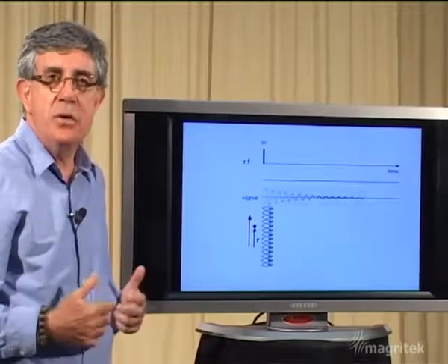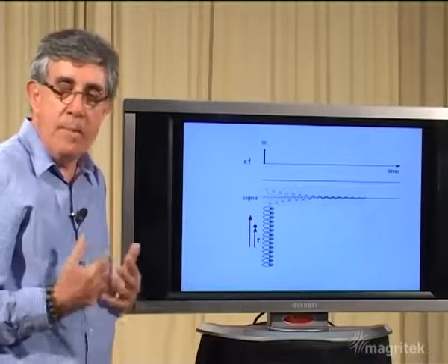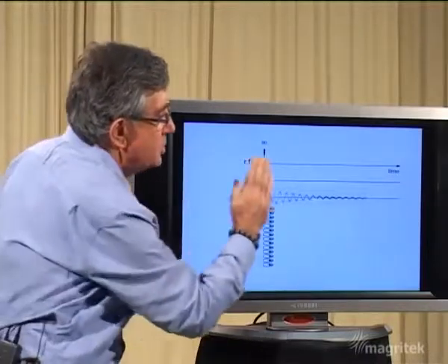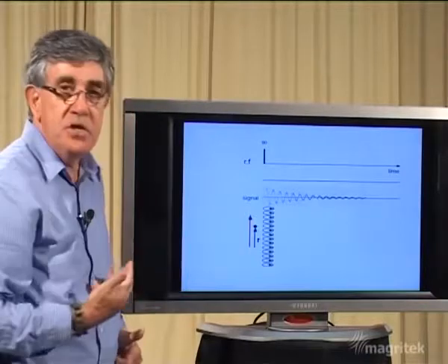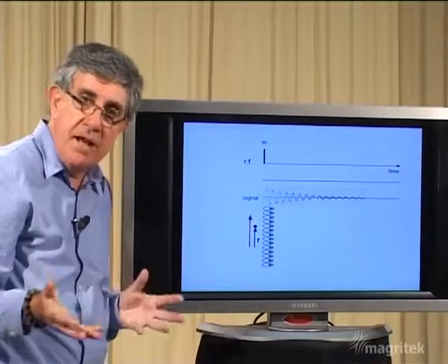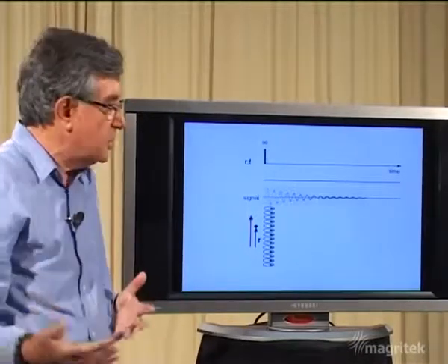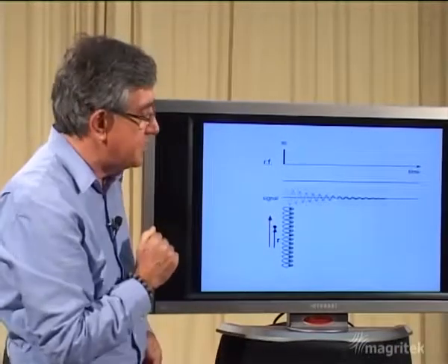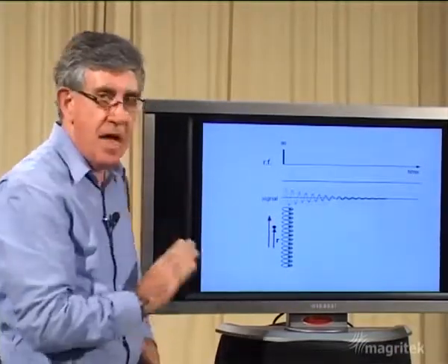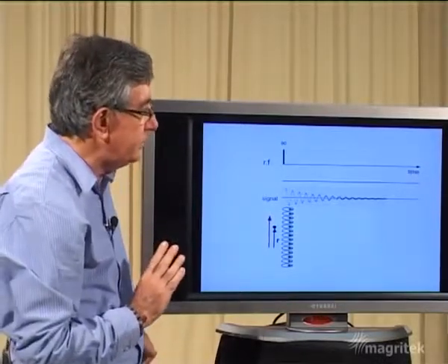So let's go back to how an MRI experiment might work. And as always, we represent that by a time sequence where we apply to the spins the radio frequency pulses or the oscillating magnetic fields required to produce the resonant effect, and we acquire the signal subsequently. And this is, of course, the most simple experiment, the free induction decay experiment. We'll start off here without any magnetic field gradients present and just remind ourselves what happens.